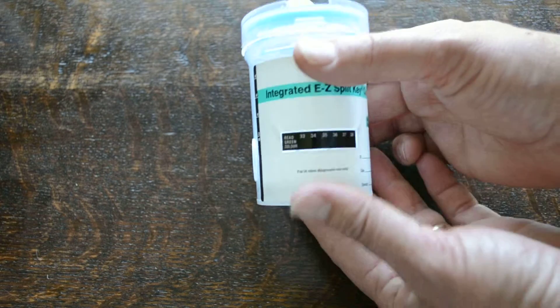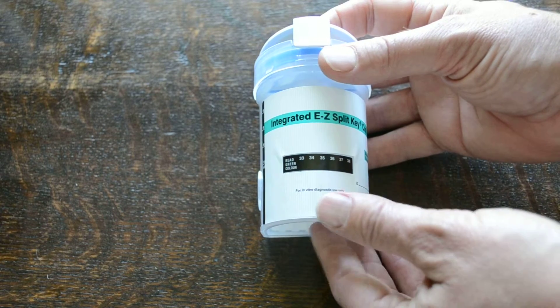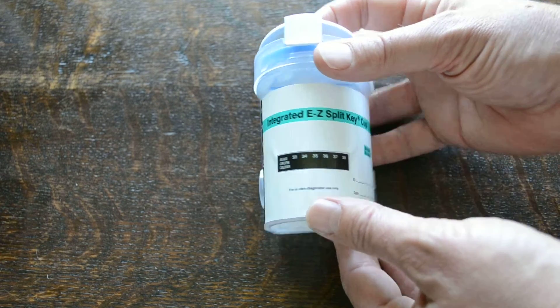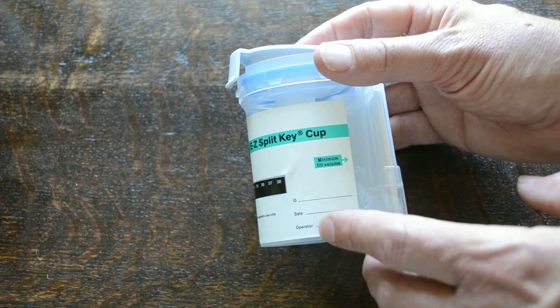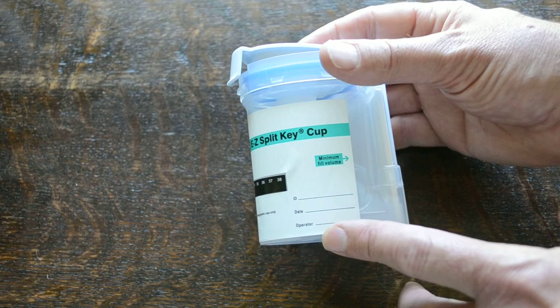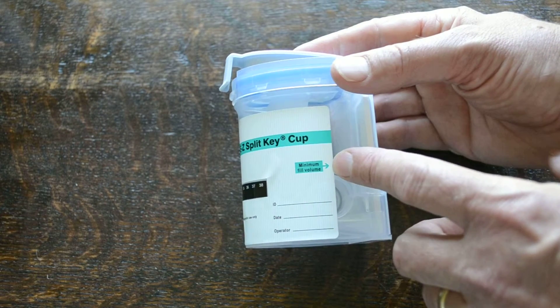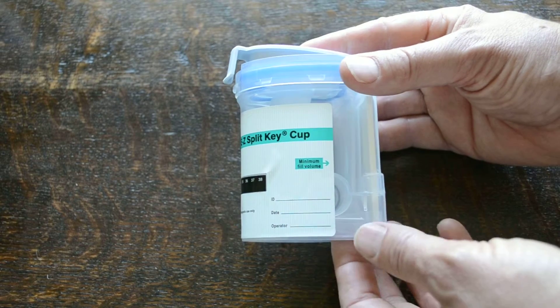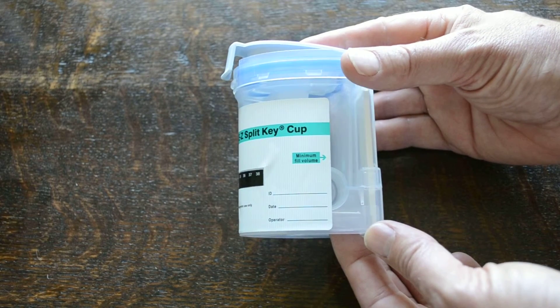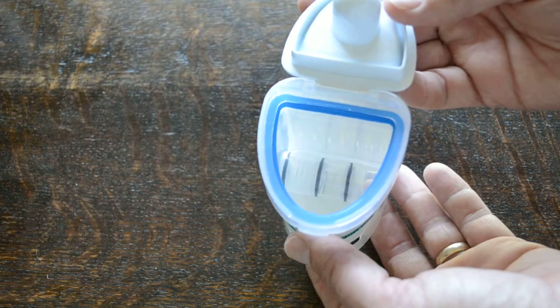On the front of the cup you have a temperature strip panel, which is your first piece of chain of custody. It also has ID, date, and operator information that can be applied, and it shows you the minimum fill volume, which you can show to the person you're about to ask for the sample so they have a guide in terms of how much urine to put into this container.